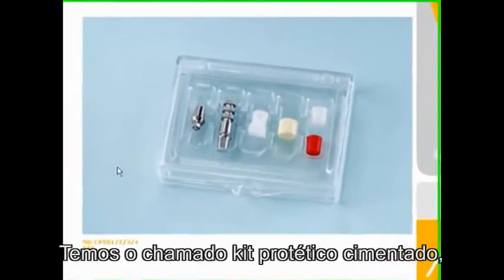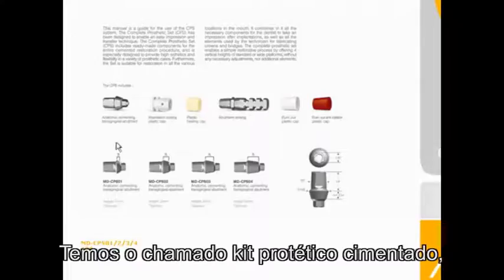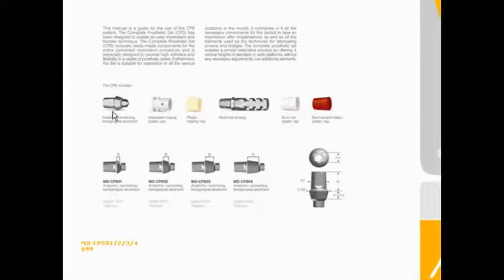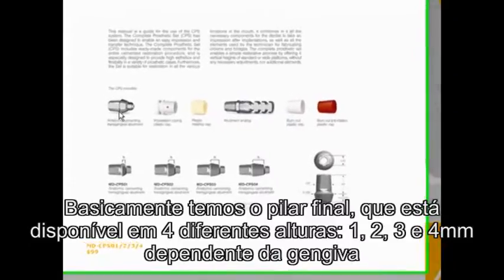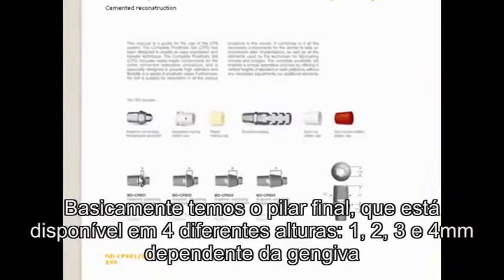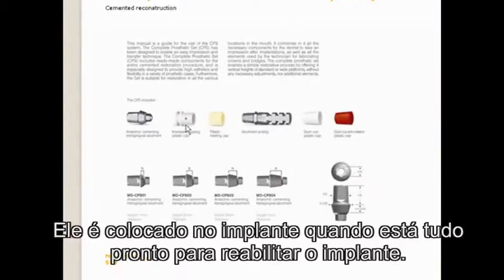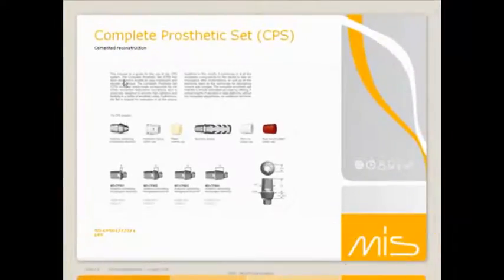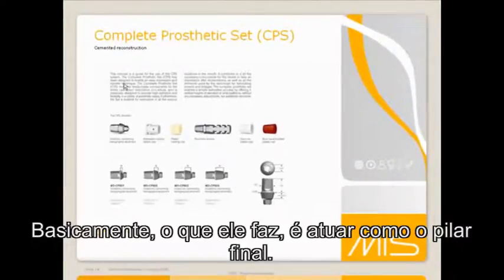We have something called the complete prosthetic set. Basically, this is everything you're going to need to restore a straightforward case when there's no need for correction of angulation. You have your final abutment, which is available in 4 different cuff heights, 1, 2, 3, and 4 millimeter, depending on the gingiva. That abutment you will place into the implant and torque down to 30 Newton centimeters when you are ready to restore the implant. Basically, that is now acting as your final abutment.